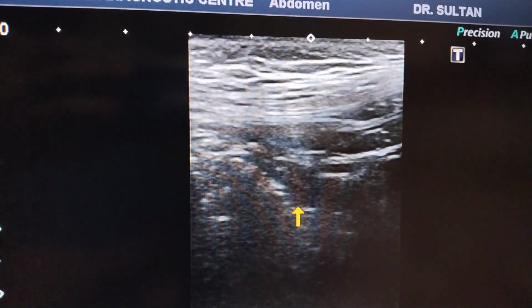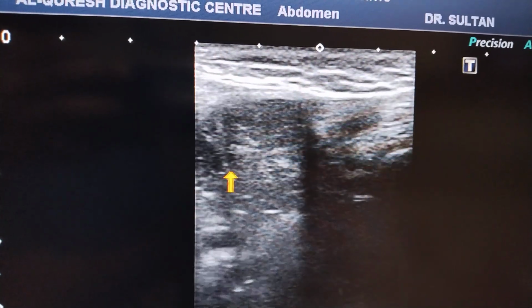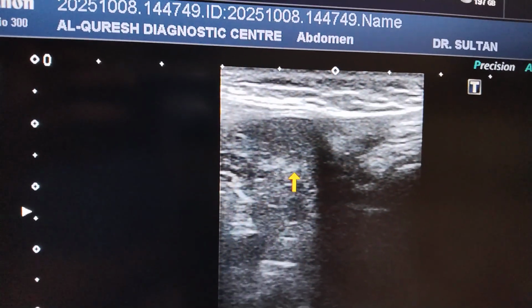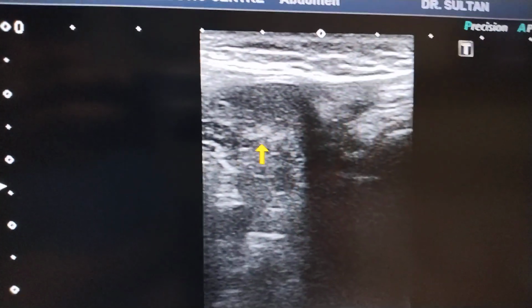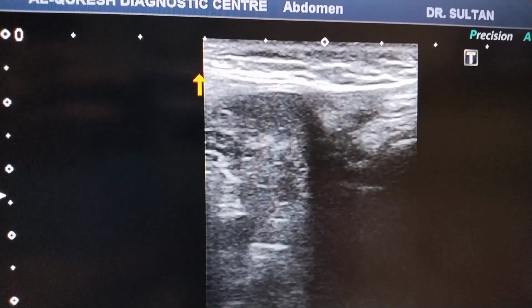So again, I am going to see it at real. Look here. Another thing I forgot to tell you. Actually, this direct hernia that projects into the abdomen actually projects into the Hasselbalch triangle.